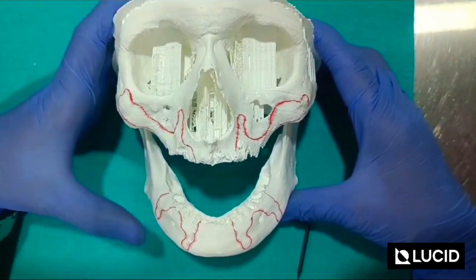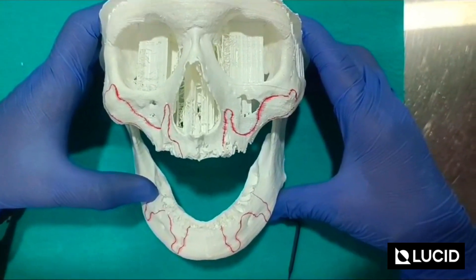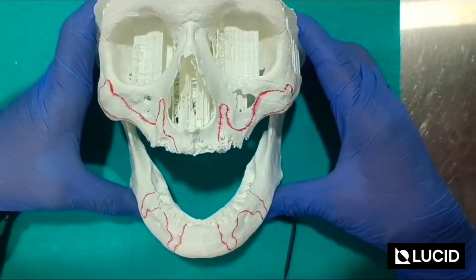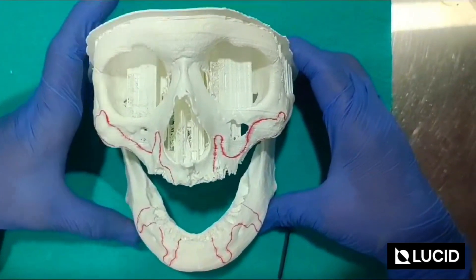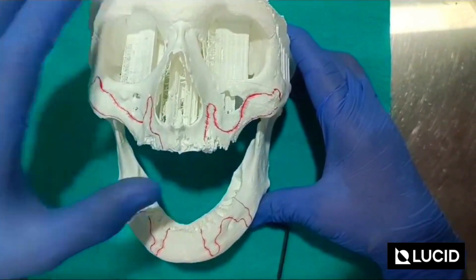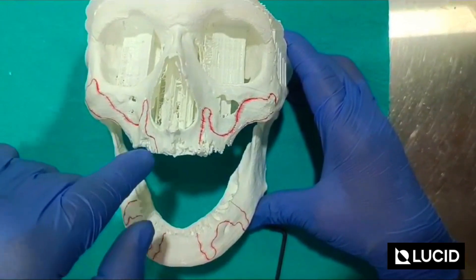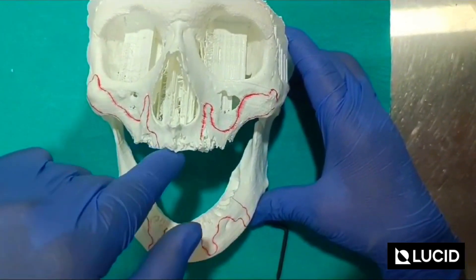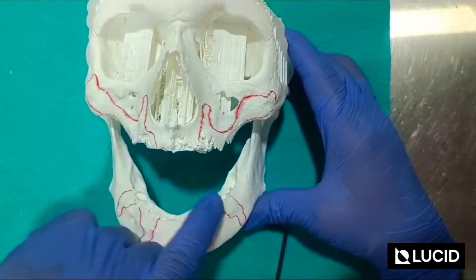I have done the marking with the red marker so you can see exactly where the implants are going to sit. You can use this model in the surgery as well. One important point: you have to trim the bone from this end with a bur — just flatten out these pieces, because there are no teeth here so there is some unevenness in the bone. You have to flatten out in the mandible also.